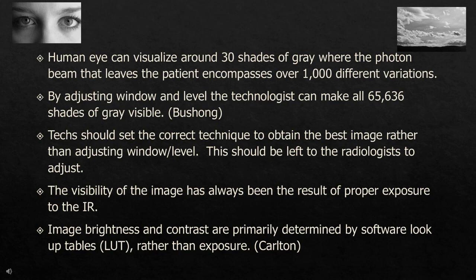The visibility of the image has always been the result of proper exposure to the IR. Image brightness and contrast are primarily determined by the software lookup tables rather than exposure.